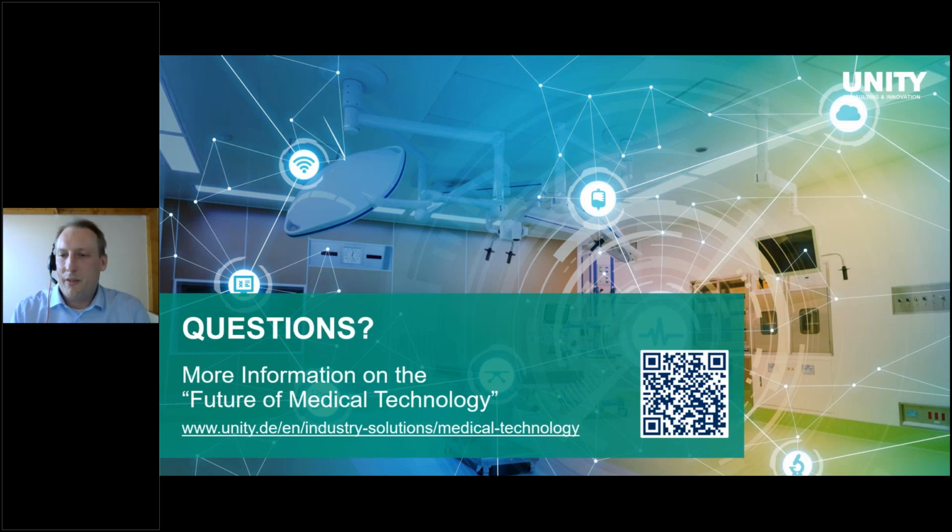There's another question if there are any plans to transfer SDC from the medical device industry to the IVD industry. So in vitro diagnostics, there are currently no plans, but I think there also don't have to be any plans for that purpose. The protocol itself is basically around exchanging data, and you can model more or less everything because it uses the classic 11073 approach on how to model medical devices. And with that, I didn't find any device that I couldn't model yet.